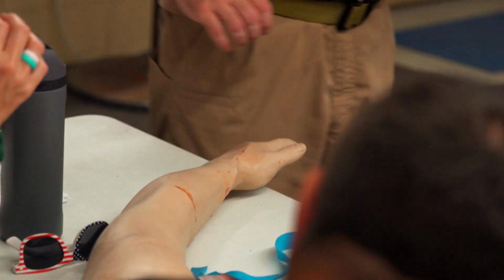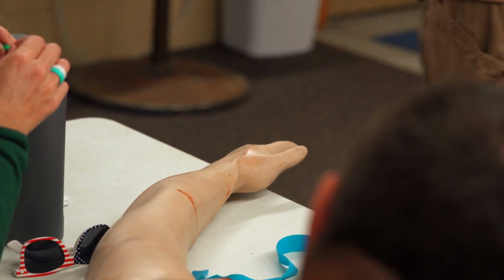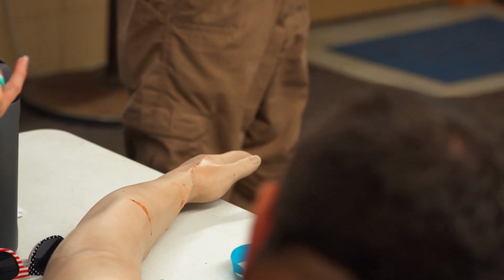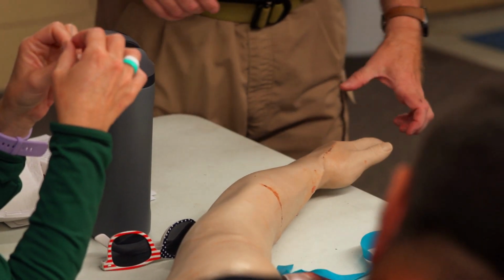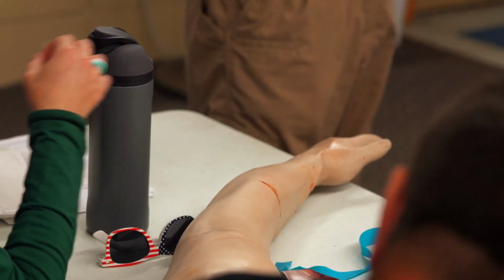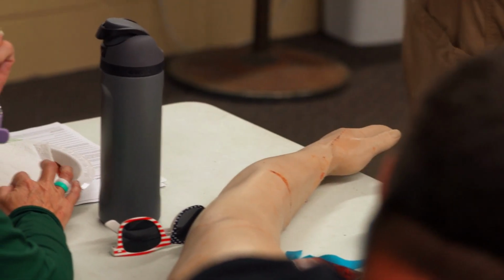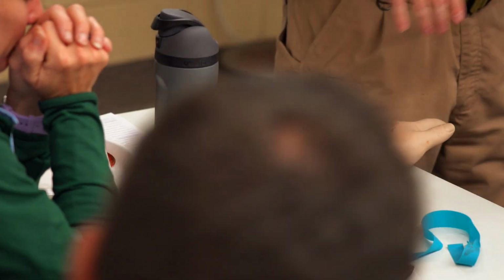I love it. Okay. So wherever you're going, some people you're going to need to do more. Some people are going to just one is plenty. So however you want to get it clean, get it clean. But once that's done, we don't want to touch that area anymore. So finding where you want to go is going to be the important part. Okay. So where we can go, there's a number of places on the arm.